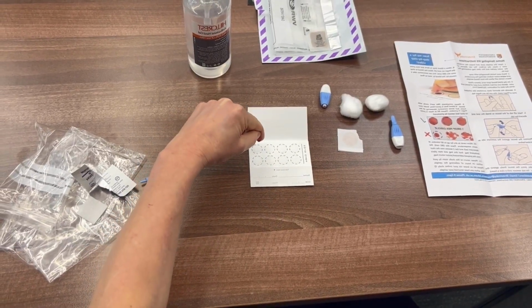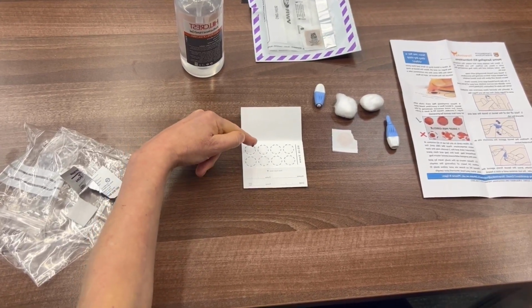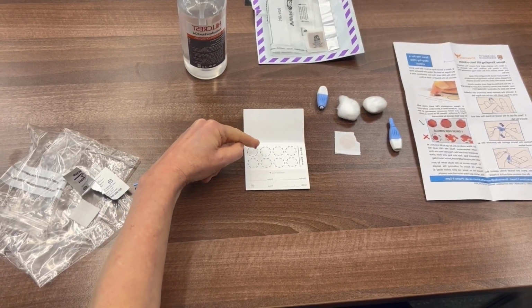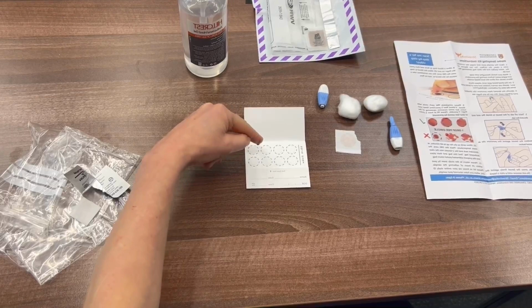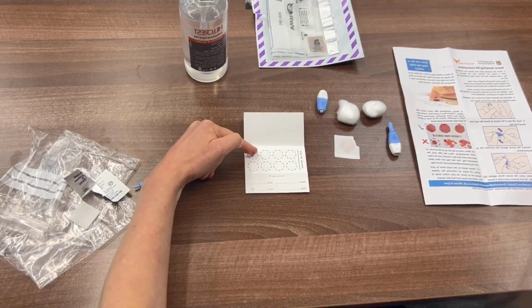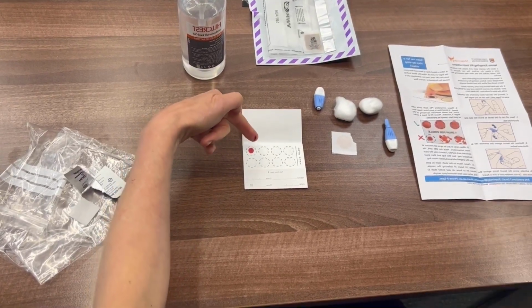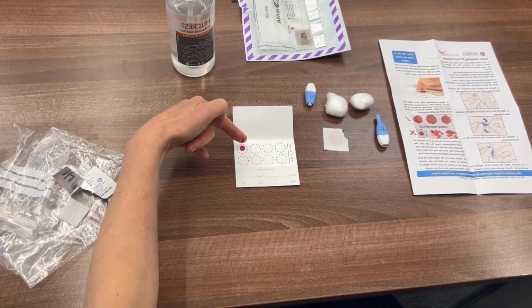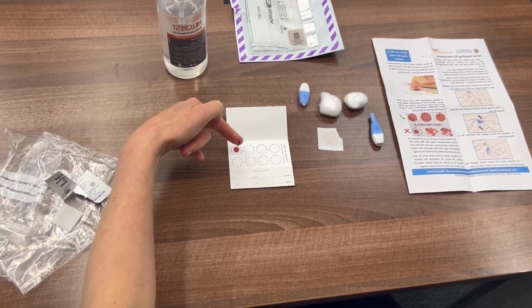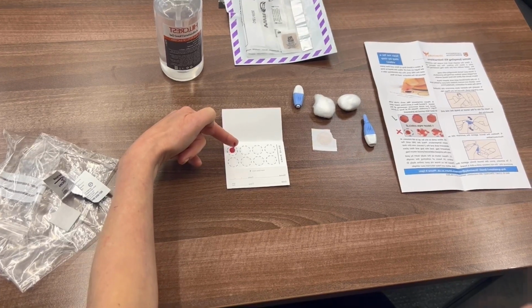So what I do is just wait a few minutes as that's coming. And you can see it takes just a little bit of time sometimes. And there, the blood is starting to come. So if you have a look at where that blot of blood is at the moment, can you see it doesn't quite fill the whole of the spot?